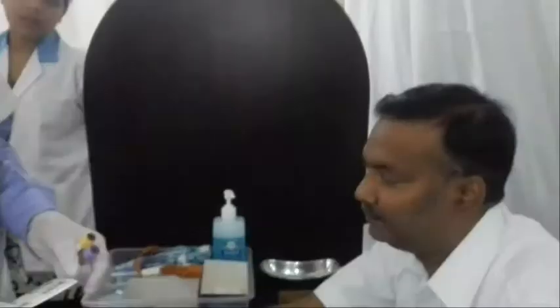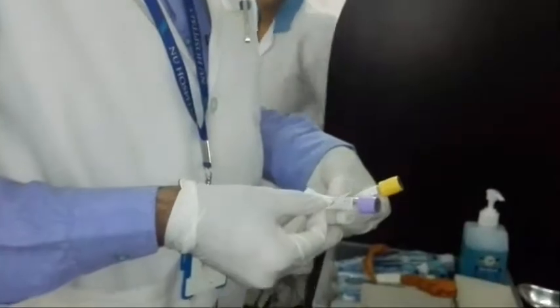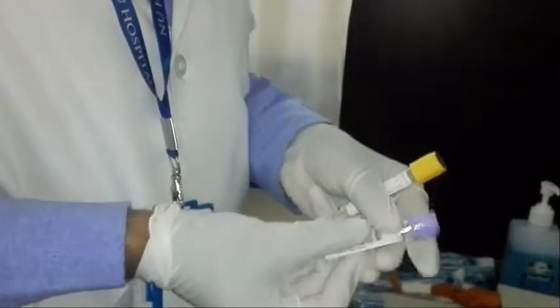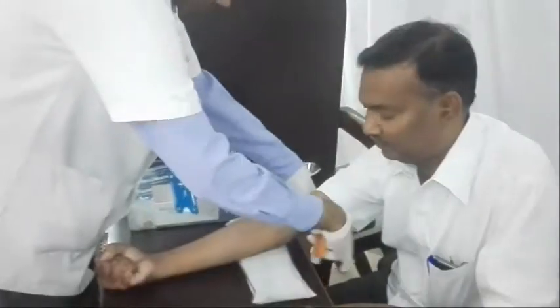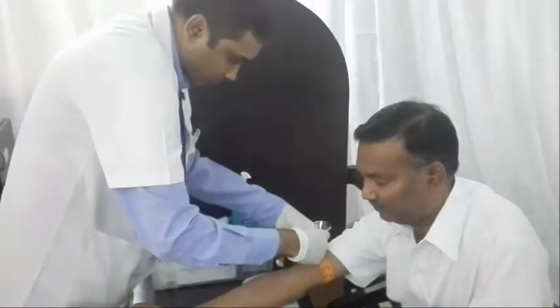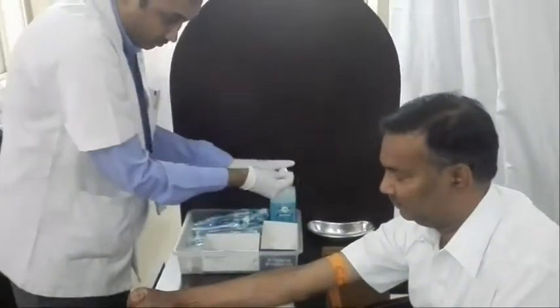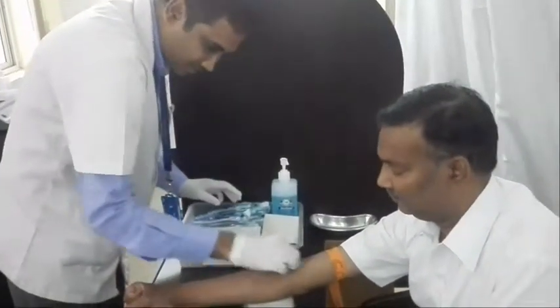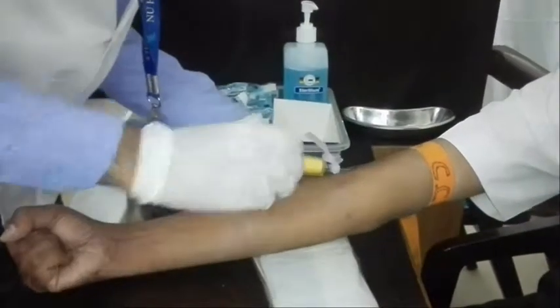The barcode is printed and is handed over to the person who is collecting the sample. The person identifies the patient and sticks the barcode on the containers in front of the patient. The person will follow strict and appropriate procedures to take the blood from the patient's body into the containers without causing any discomfort. This process is handled only by a well-experienced person.